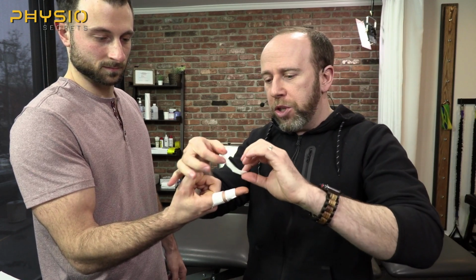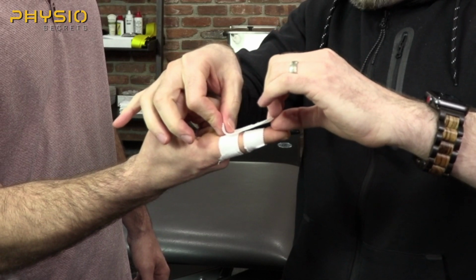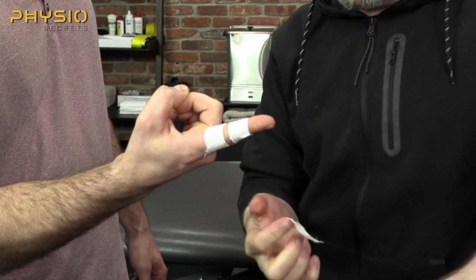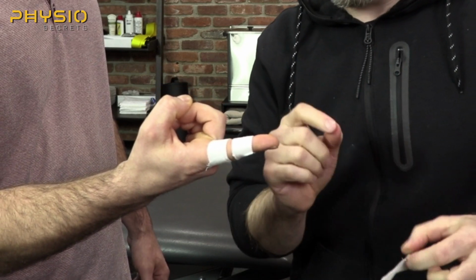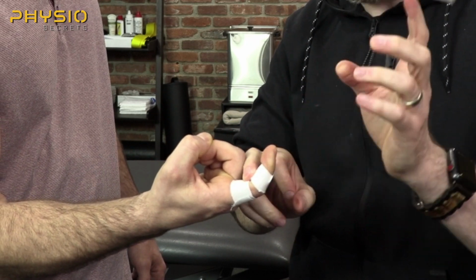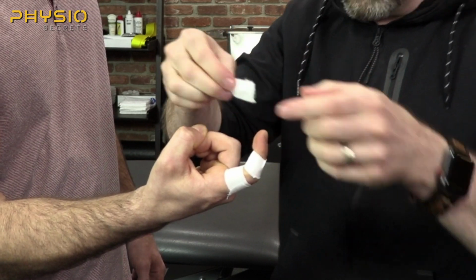So now I'm going to use my support strip. When I apply my support strip, I have to basically get it so that it fits between this point and this point. So that's why I use athletic tape here, just so it's easier for me to show you guys. And I want to pre-position his finger in the position that I want to keep it in. So if I give him a bit of flexion, now I know the tape's going to stretch a little bit, so I'm going to flex him a little bit more.